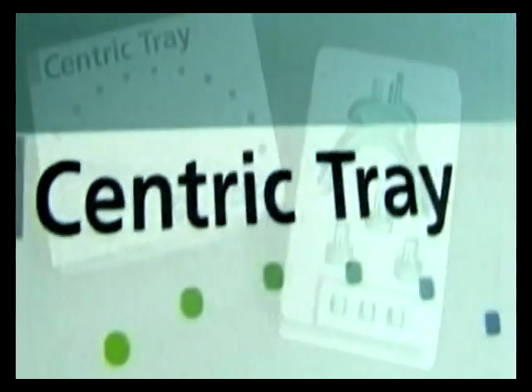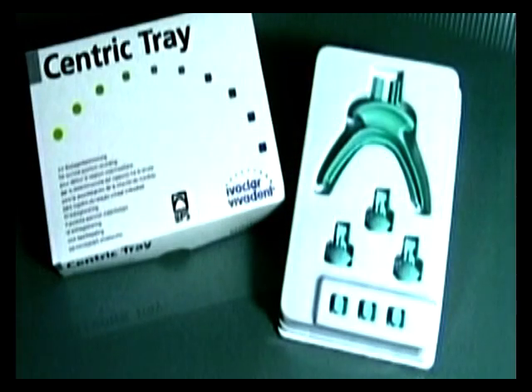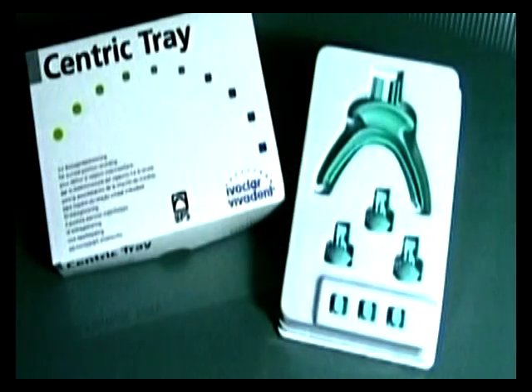Centric tray. The centric tray permits the transfer of the occlusal position to the individual impressions. In addition, the tray allows the physiological unity of the stomatognathic system to be maintained.